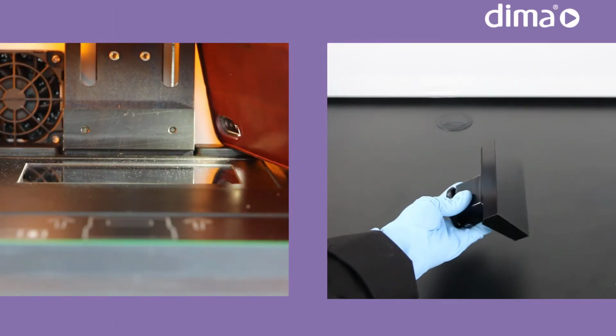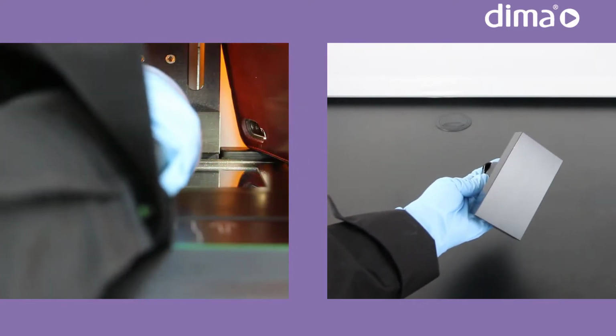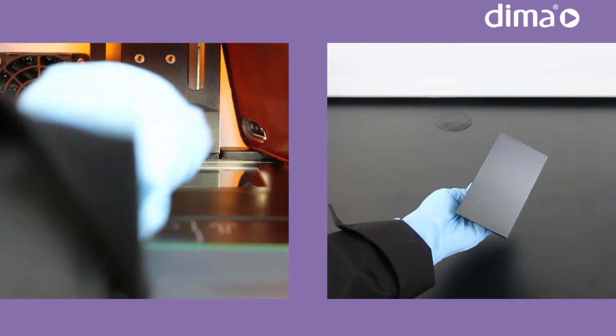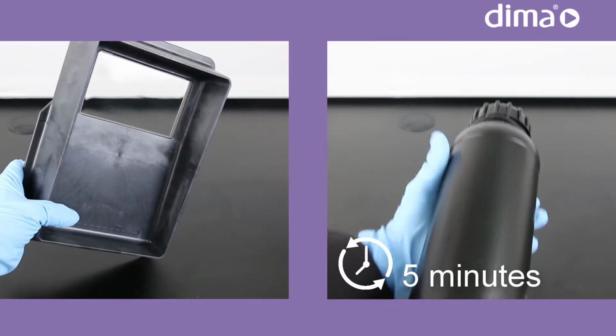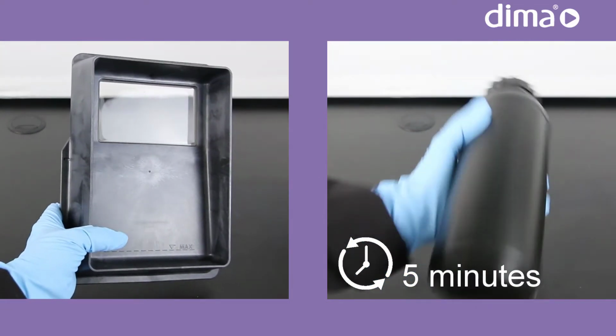Check the exposure area in the printer and the printing platform for cleanliness. The best way to detect contamination in the printer is to use a lateral illumination, for example from a mobile phone lamp. Also check the material tray for cleanliness and shake the material for at least 5 minutes.